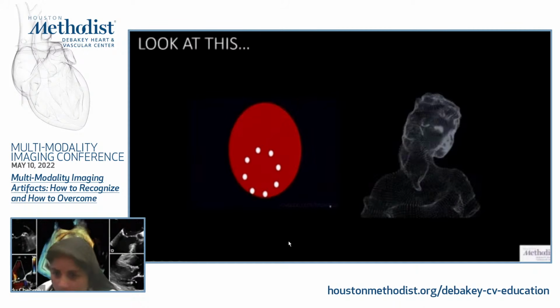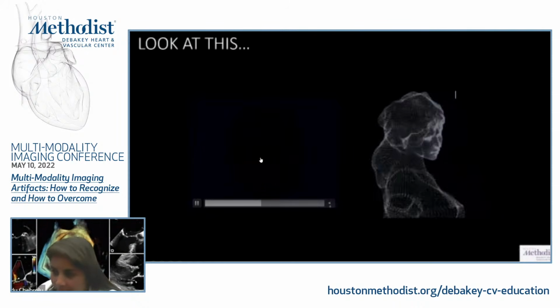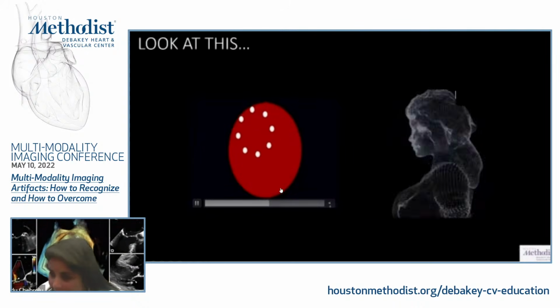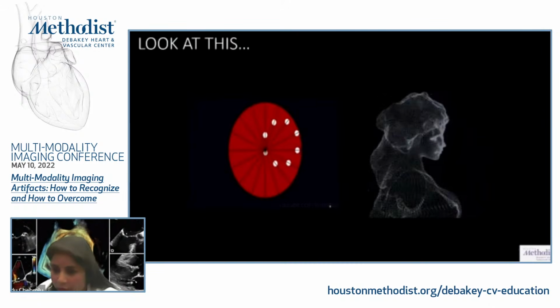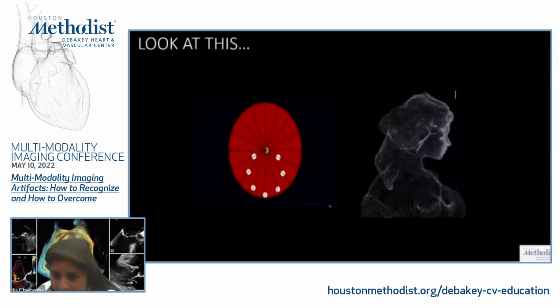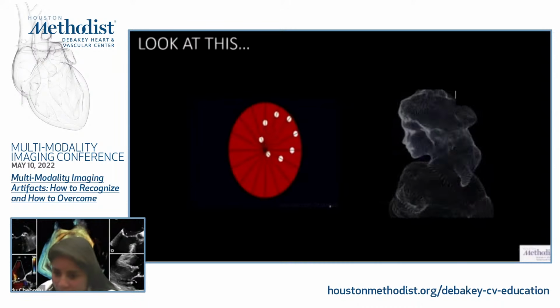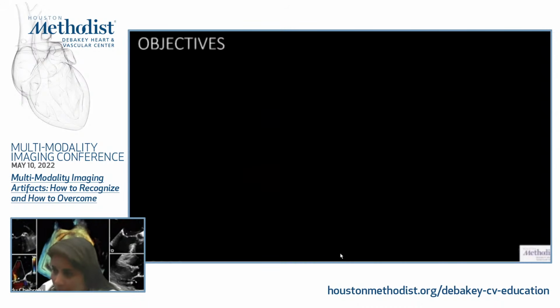Are all these balls moving in a circle? Can you guess which way this is moving? Actually, these balls are moving in a straight line. I'm trying to get to the point that we make a lot of assumptions about ultrasound, and it's not always clear when it comes to ultrasound artifacts. Knowing the application of ultrasound physics and understanding them is very important.